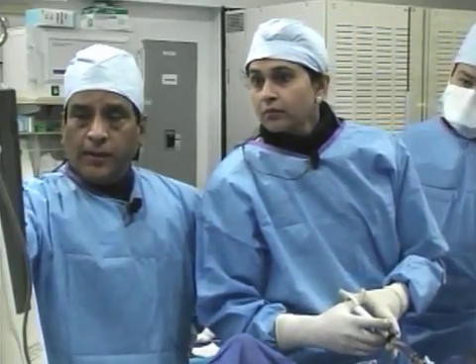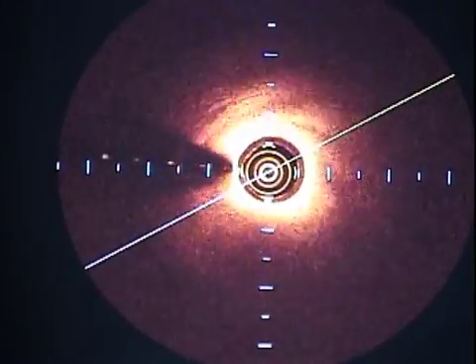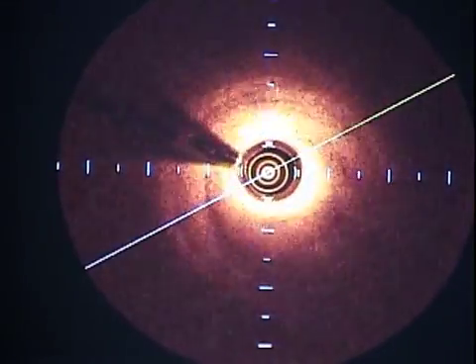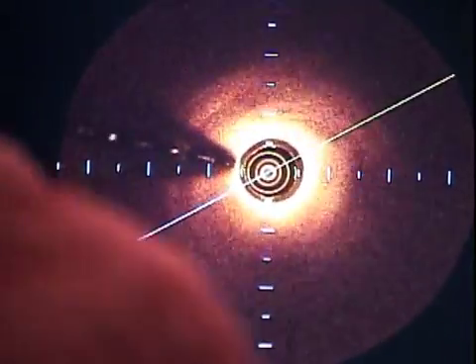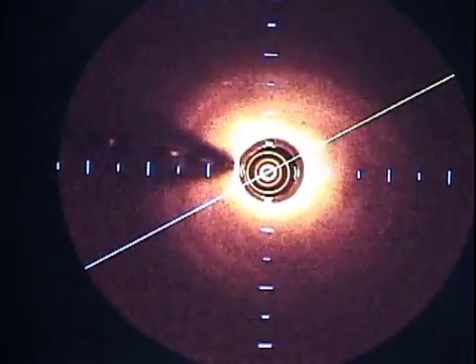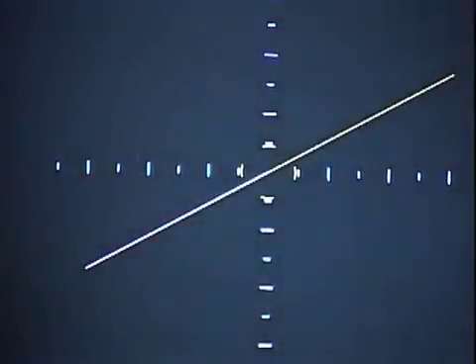Now just go over 1 second. Now they want to show basically. No, let's make sure it's working. Okay, good. So now we are actually doing the, are we ready with? Okay, now you can see the camera on the other side. No, it's shown already. Good, very good.